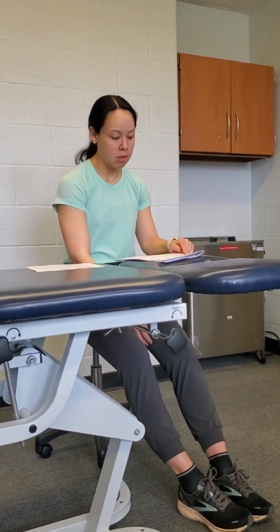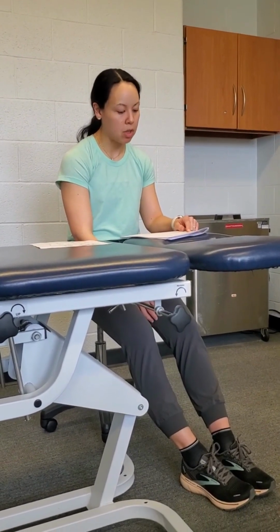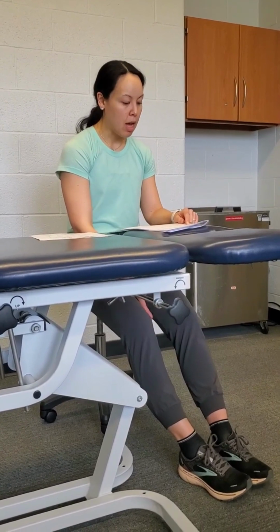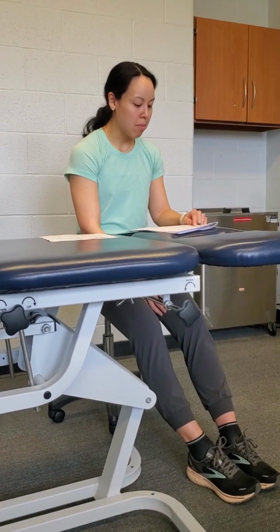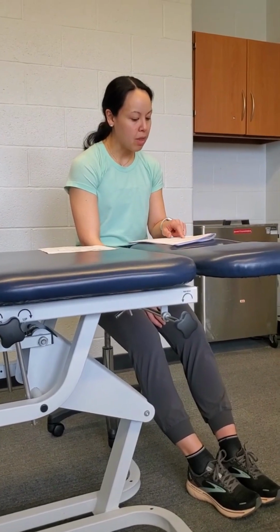There's a lot of different things. So the cuff width, systolic blood pressure or limb circumference of the particular patient, body position, female or male, limb density, and laterality. The cuff width and the limb circumference are the biggest factors.